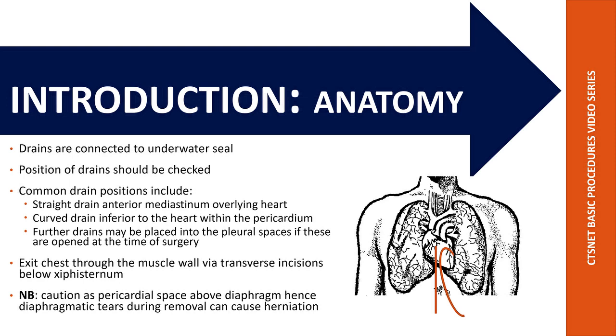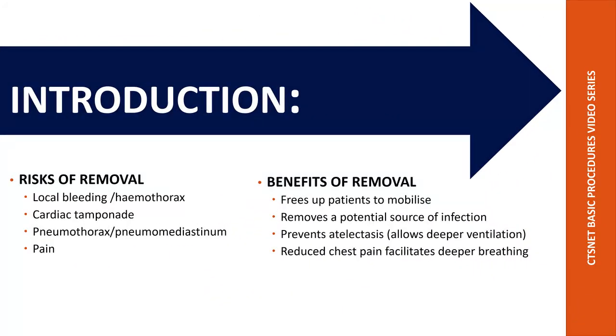Be extra careful as the pericardial space is above the diaphragm, hence diaphragmatic tears during drain removal can cause hernias. In this way, both drain insertion and drain removal can cause diaphragmatic injury. The risks of drain removal are localized bleeding, hemothorax, cardiac tamponade, pneumothorax or pneumomediastinum, and pain.